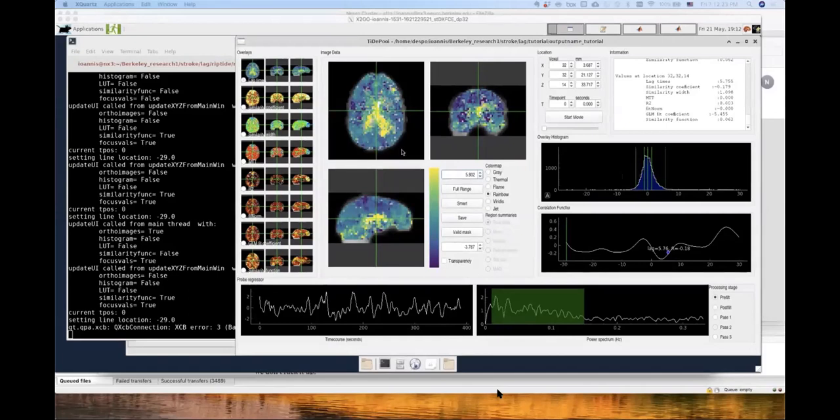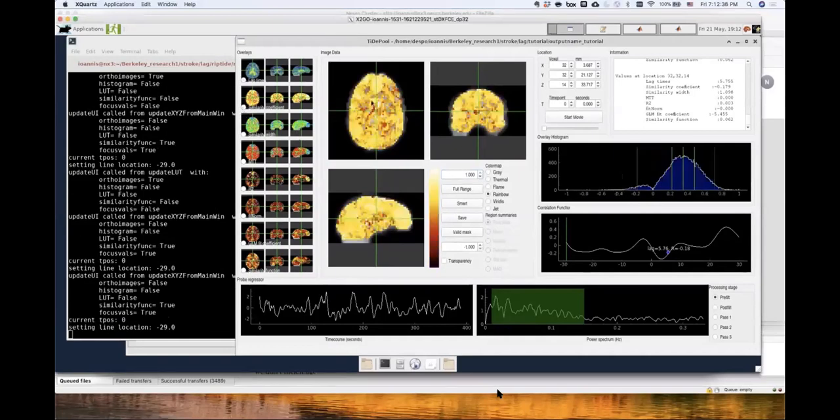Obviously, one might not be just interested in the lag times and can click on the different options. This is the correlation value, again the maximal correlation, at that particular lag time with the probe regressor.